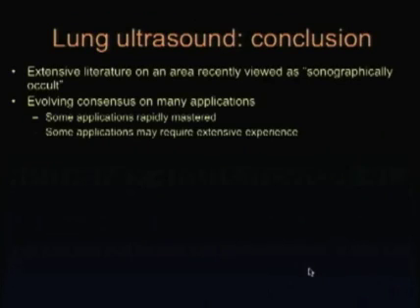So finally, to conclude, we should be aware that an extensive literature has emerged over the last 5 years and even more remotely on lung ultrasound, which is an area that until recently was viewed as sonographically occult. There's an evolving consensus on many applications. Some are more rapidly mastered than others.